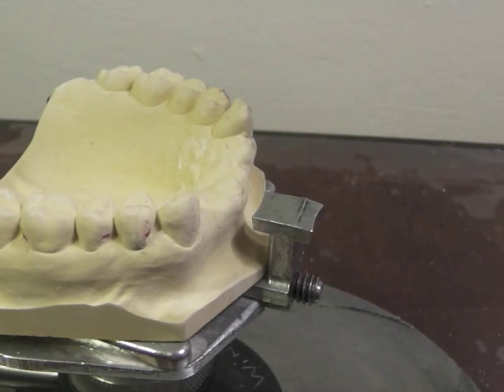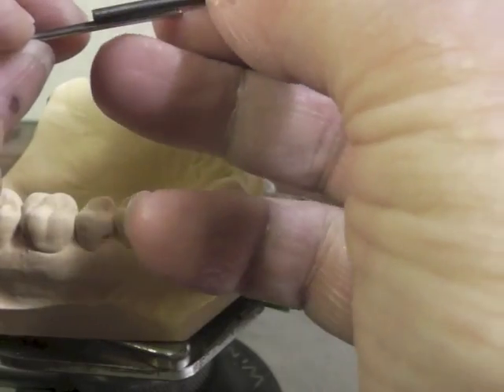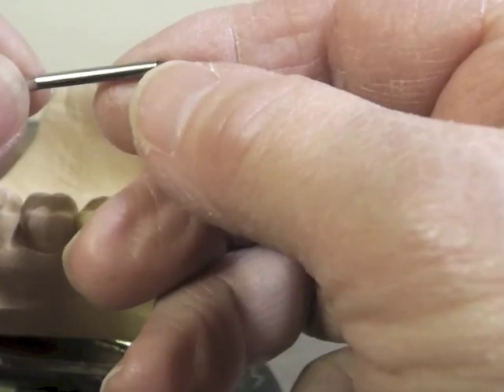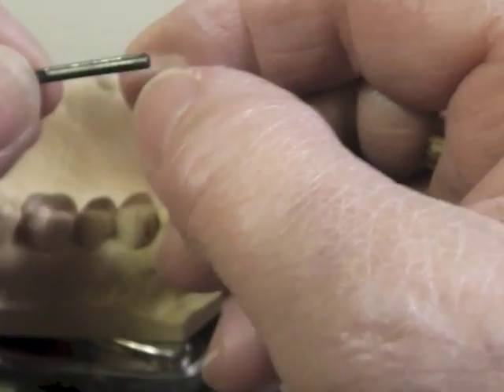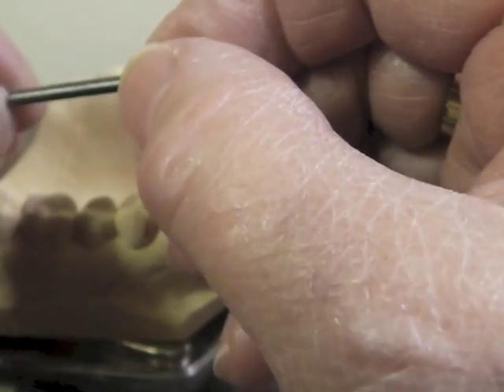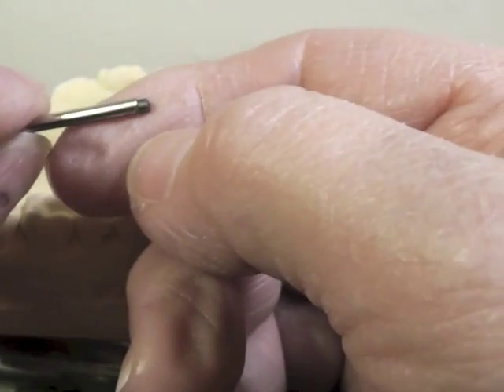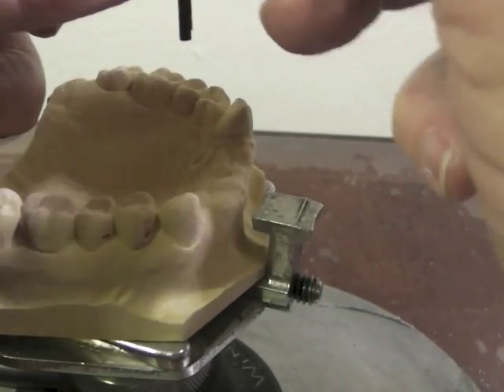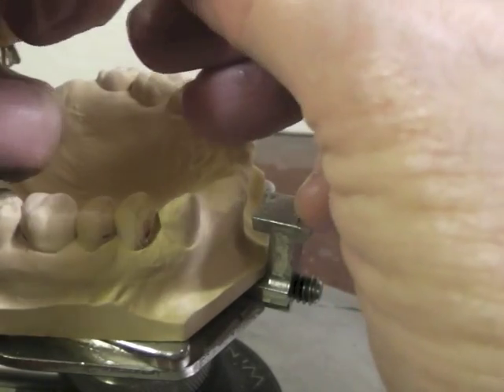I like what I've got here. I have the undercuts in the positions I want, and they're relatively in the gingival one-third of the tooth, which is a good location for them. I'm going to go ahead and place the lead in the sheath. You want the lead to be sticking down a little lower than the sheath, but it's protected by that sheath to keep it from breaking when you're going around the teeth to survey them.